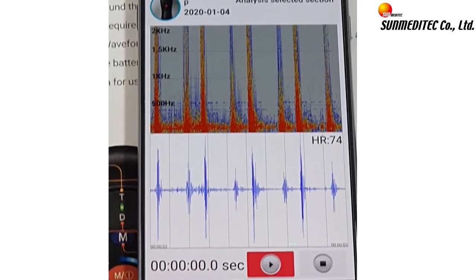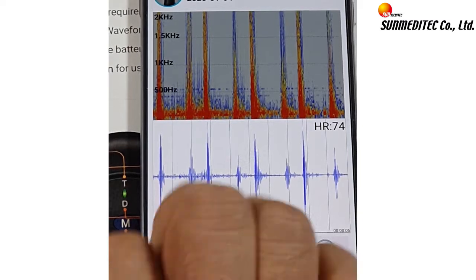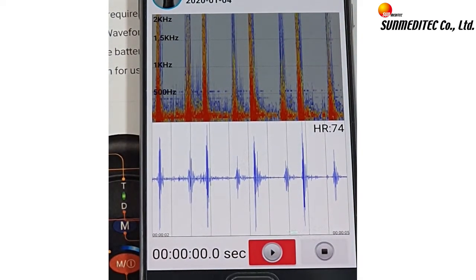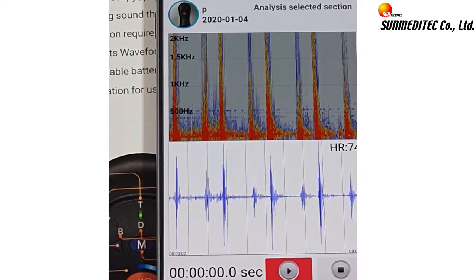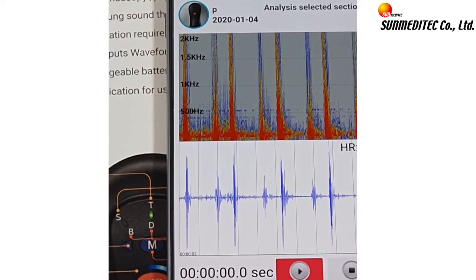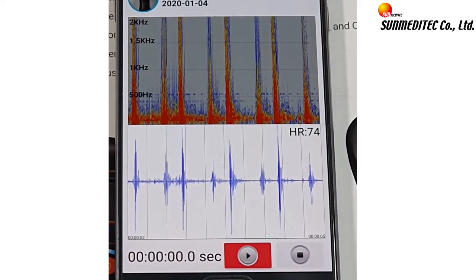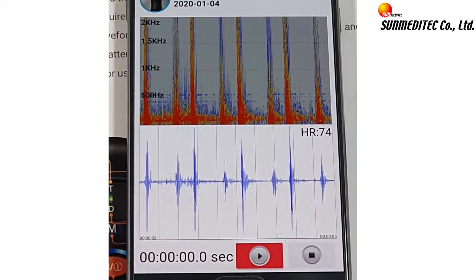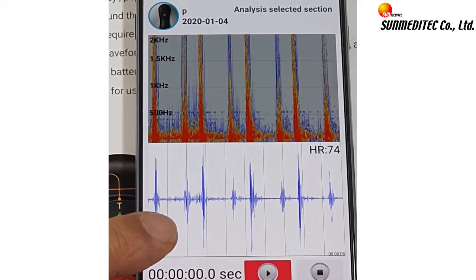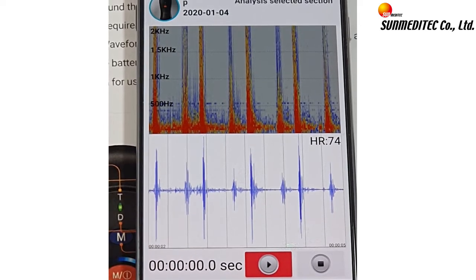Waveforms and spectrogram for auscultation sound are displayed. Red means the density of the power spectrum, that is, very powerful energy. Generally, a spectrogram of 500 or less means healthy. But for a diseased person or bad state of health, the red color displayed is widespread and high. The constant and rising amplitude of the waveform means that the heart is very healthy.